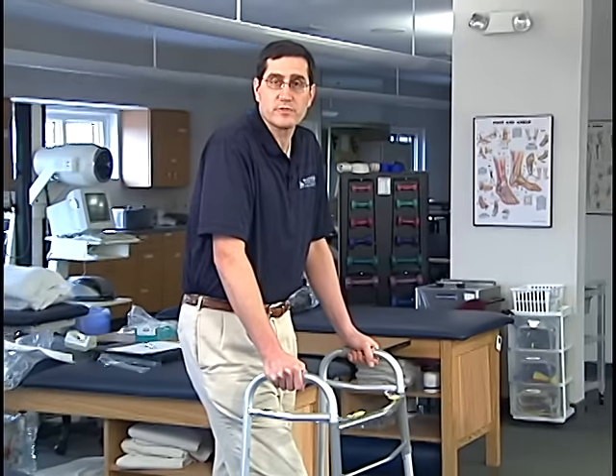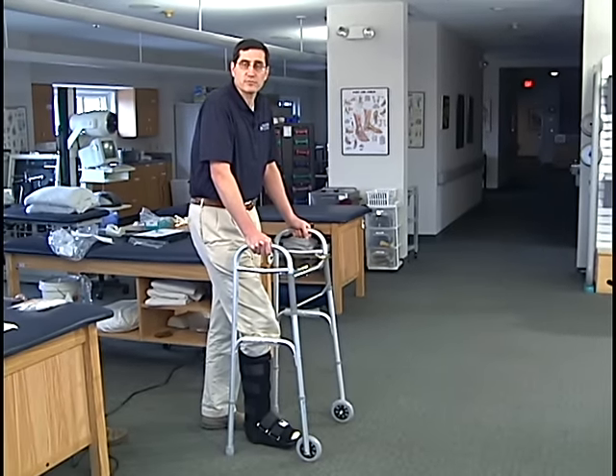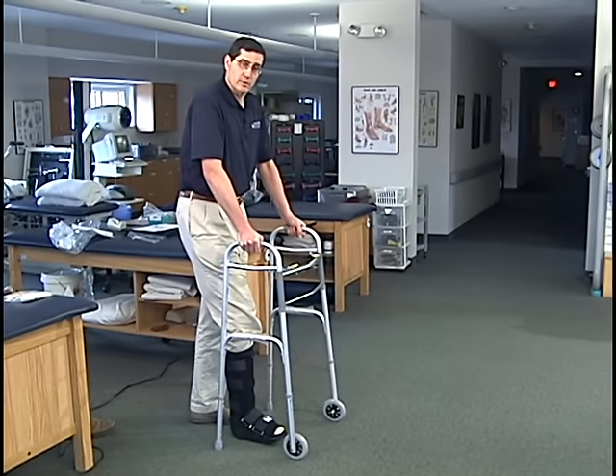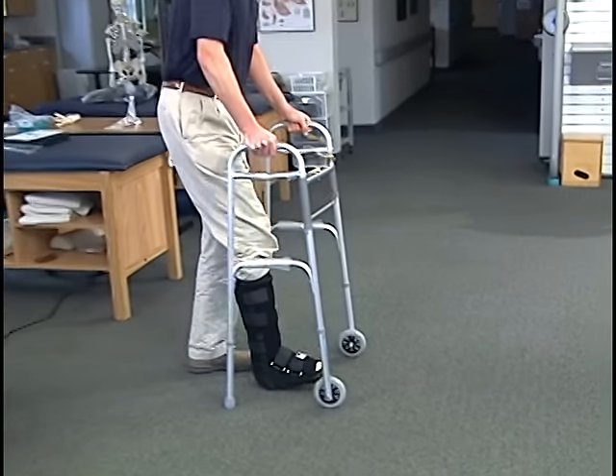For those patients using a walker who are required to do 50% weight-bearing, it involves taking one step at a time as opposed to vaulting over the crutches. Put about half your weight on your hands and half the weight on the foot and walk across.